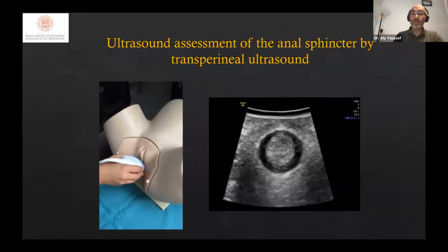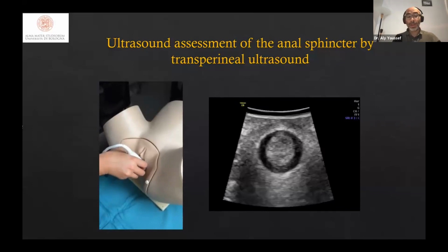The assessment ideally of the anal sphincter is by 4-dimensional ultrasound. It's a complex technique and it was extremely difficult to include in the lecture.